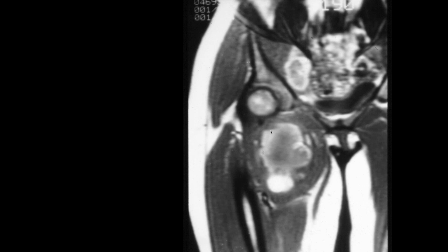Right, this looks like a hematoma, kind of bright around the edges with a dark center in it. So a lot of mass effect here. This is really a hemorrhagic mass. Yeah, I would worry about the hemorrhagic mass on both sides of the joint, which is something that's characteristic of this particular lesion, in large part because it probably grows across compartments. So what do you think it is? For a hemorrhagic mass, I would worry about synovial sarcoma.